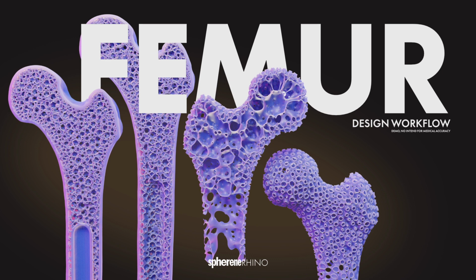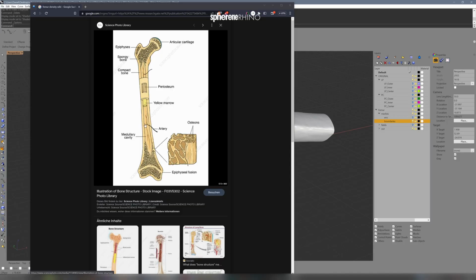Today we make a femur bone using sphereneRHINO with help from standard Rhino commands. The femur bone has a cavity on the inside. It has a wall thickness on the outside like a hull, and then we have these spongy structures. Let's try replicating this in sphereneRHINO.